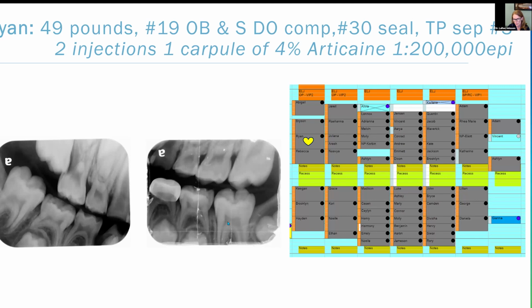So for example, hyperfocus on the bone between tooth 19 and tooth K. I want everyone to appreciate on the crest of the bone how opaque that is right there. That is going to be a more challenging place to inject into versus look at it on this side. For whatever reason, it's less organized, it's less opaque. This bone is going to be much, much easier to inject into.